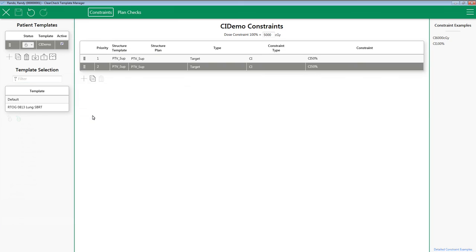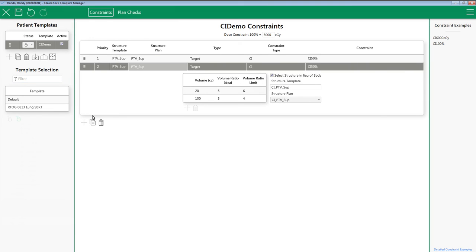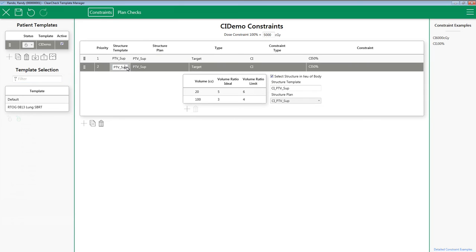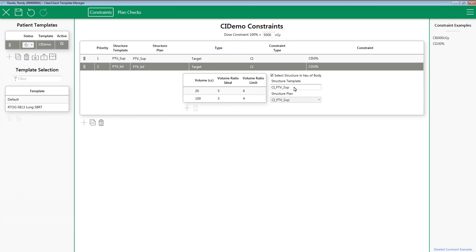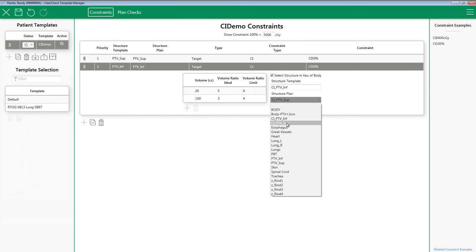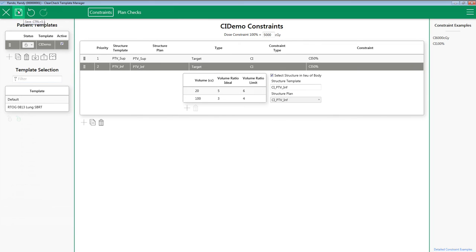In ClearCheck, I'm going to copy the CI constraint that I already have. Table remains the same. Edit Structure Template to PTV Inf. Change dropdown of Structure Plan to PTV Inf. And now all I have to do is change the Structure Template name to CI PTV Inf and associate the correct structure from Eclipse.